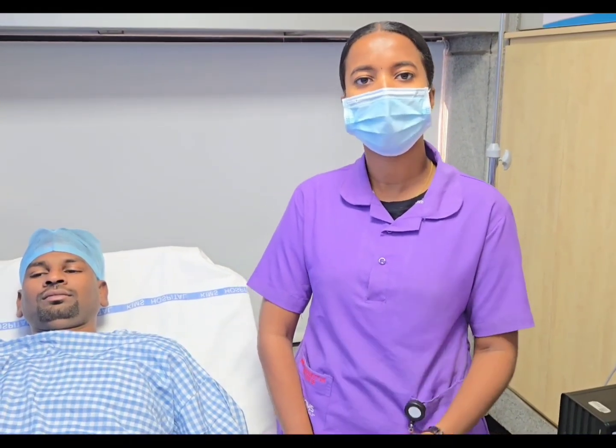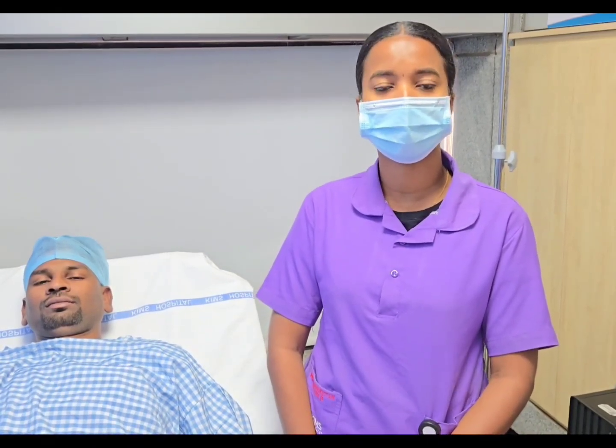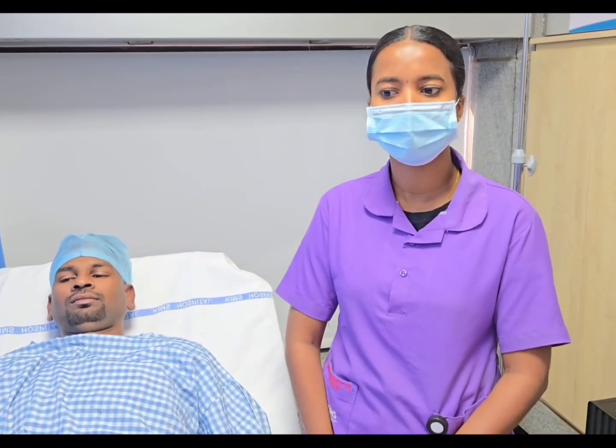For which patients do we not use the NPA? Where there is any facial deviation, any facial trauma, any nasal septal deviation, any trauma, any nasal polyps, or evidence of a CSF leak, we do not use this NPA.